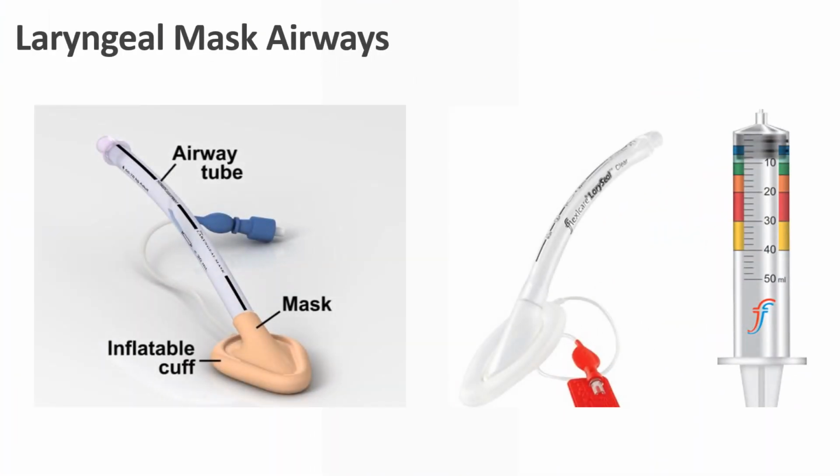Questions about that? Pretty straightforward, huh? As long as you've got a good one, it's straightforward. How many have ever put in a laryngeal mask airway? Okay, they're kind of unique. Take a lot of air. We'll watch this video and we might be pretty close then to getting to what I would call lunch after we watch this video.